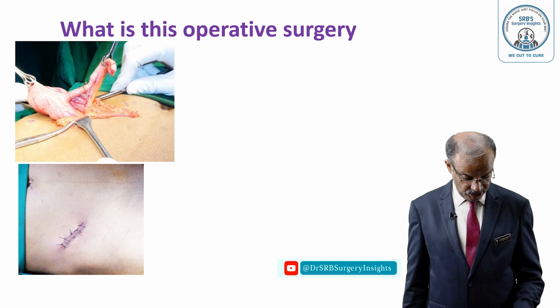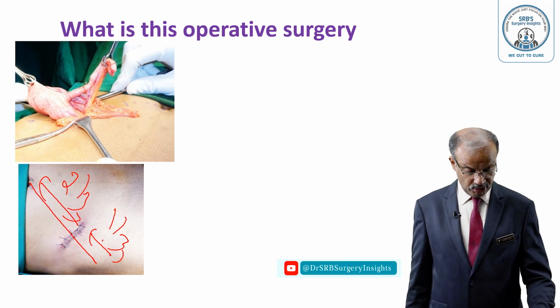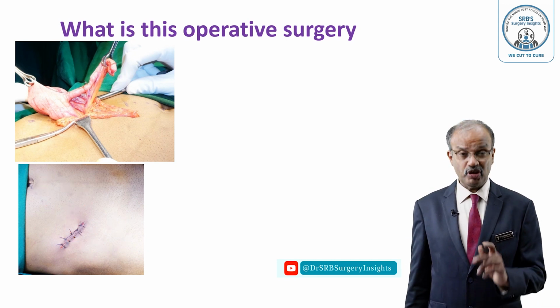This is the appendicectomy. See that spino-umbilical line. This is the McBurney incision, McArthur incision. Lateral 1/3 and medial 2/3. Lateral 1/3 and medial 2/3. So this is operative open appendicectomy.